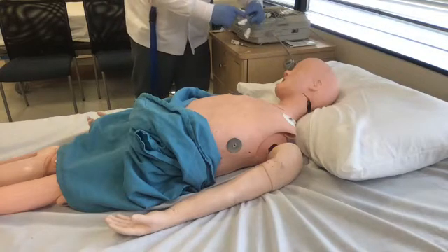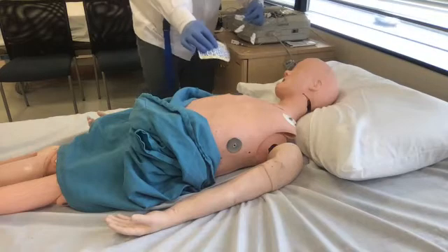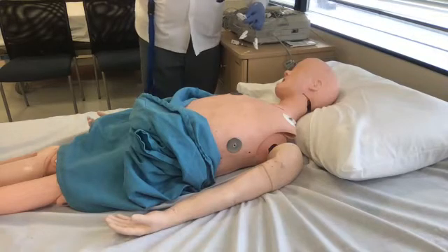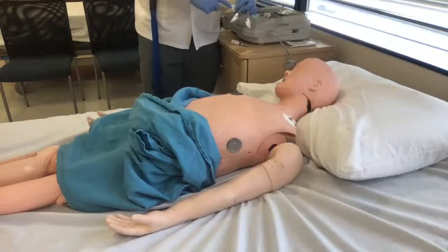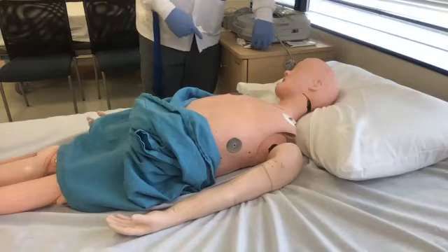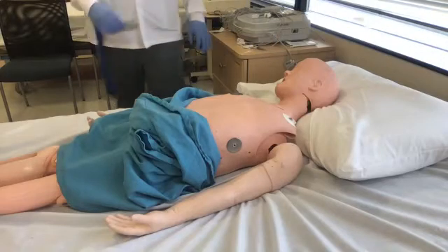Another thing you also have to check is these electrodes, they're sticky, especially the cheap ones. And you can get a lot of schmutz in here. I used that word twice today. Isn't that neat? I'm using Yiddish words now for medical terms.